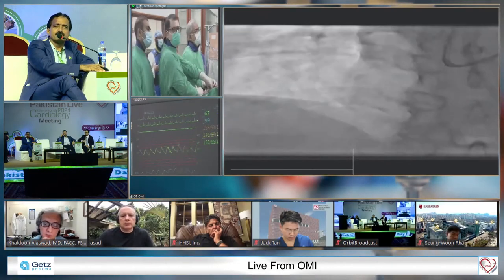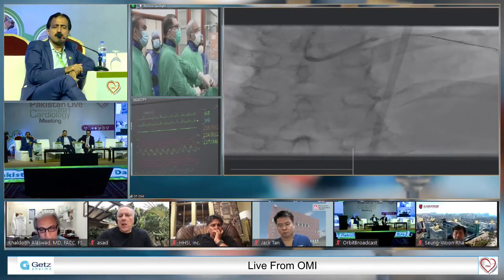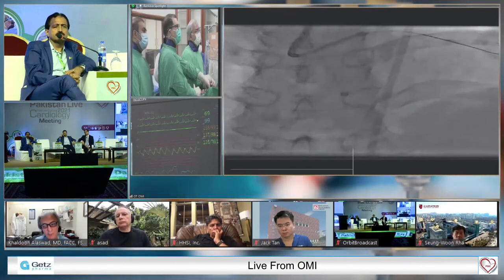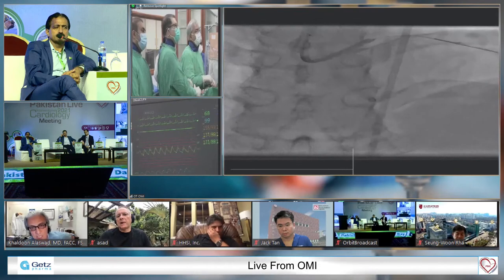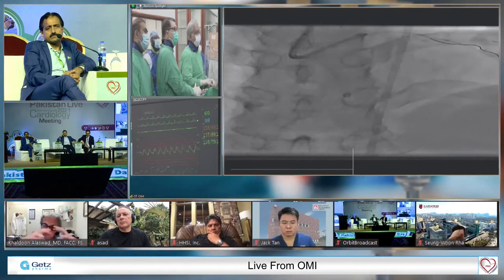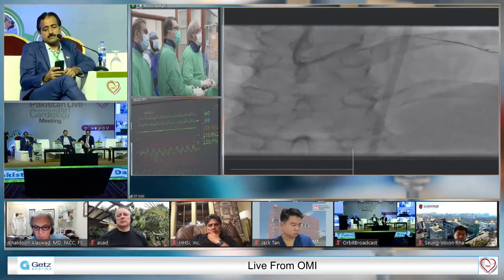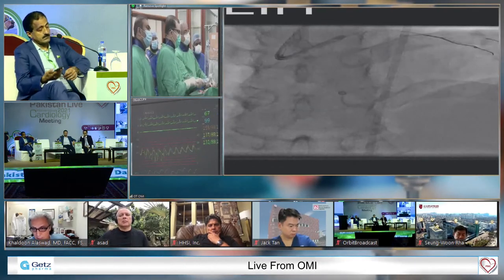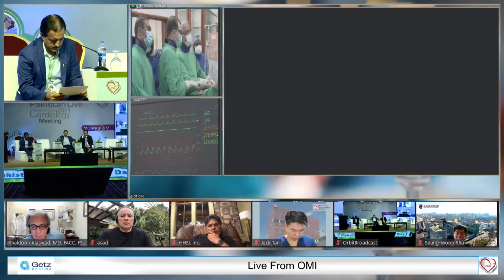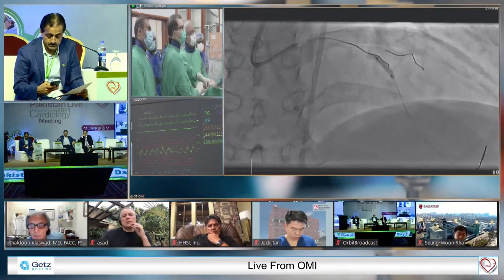I just want to make this comment for everybody in the audience, especially those who are trying to start a CTO PCI program. You have to remember the distal bed after a CTO, a lot of time there is negative remodeling. So you do not really have to do a lot of things in the distal bed. Don't keep chasing it down. A lot of times if you come back 3 months later, there will be 30% positive remodeling. The vessel will plump up. This is a situation where I'd give a lot of nitroglycerin, nicardipine, whatever you use in your cath lab, and then take an angiogram. And we tend to use IVUS 90% of the time, and 100% of the CTOs we use IVUS. So we always do IVUS to decide what the distal bed looks like and the side branches, if they need to be protected or not.